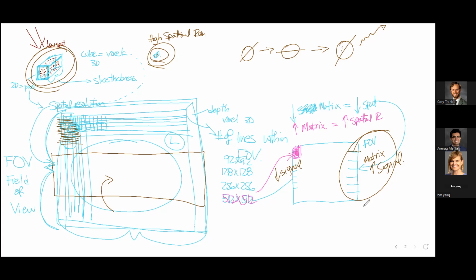The longer the unwinding, that's T1. Why would we use a 3T scanner? It winds the protons tighter, and then when they go back to their original orientation, they release more energy. That's the advantage of 3T versus 1.5. You get more signal because there's more unwinding. Okay, you want to think about it that way.